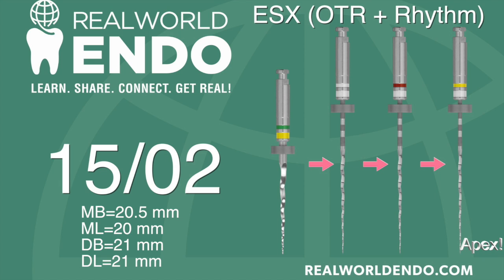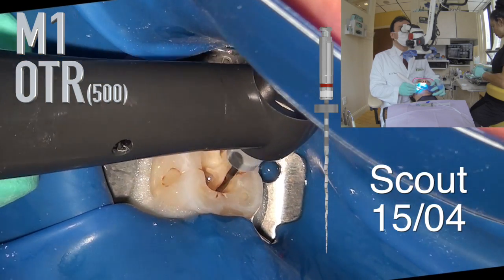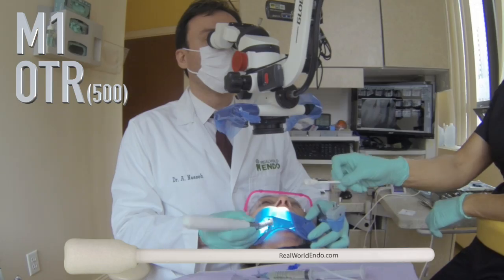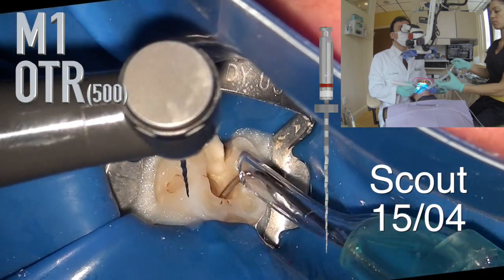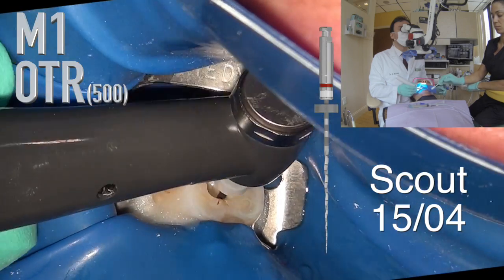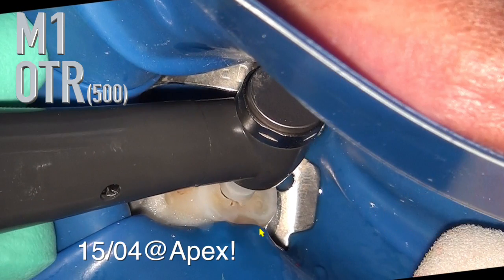So as planned, after the orifice opener and hybridization of taper, we got ourselves down to a 1502 file reaching the apex. Now the goal is to get the 1504 down to the apex. We switch to the 1504 and move back to Memory 1, which brings the speed up to 500 rpm with OTR. Again using the rhythm motion — three strokes to engagement — removing the file and having the assistant use the Endoswipe to clean the flutes from debris. Between every rhythm motion or every two rhythm motions, make sure you're irrigating to remove debris. You're not pushing the file; you're very gently allowing it to follow the original path created by the 1502 scout.